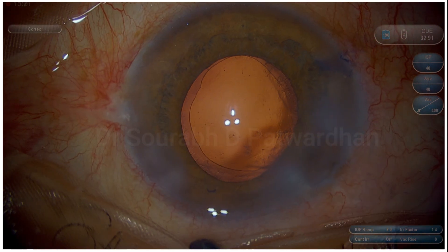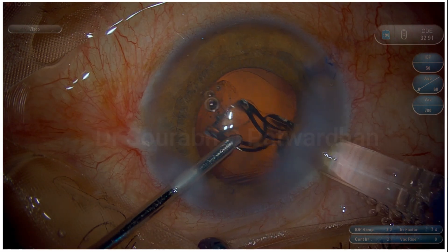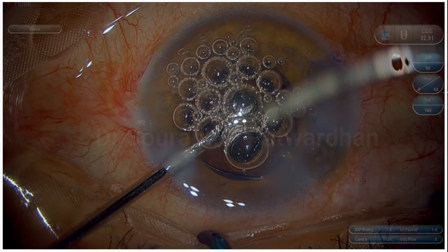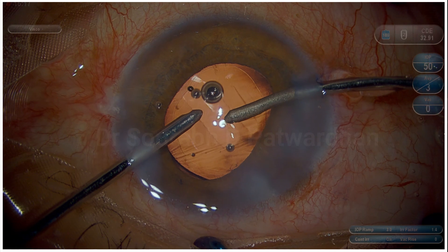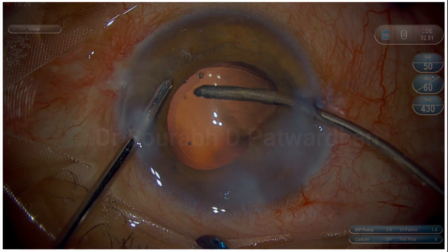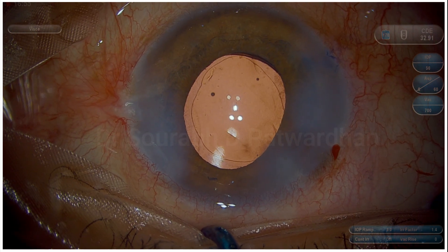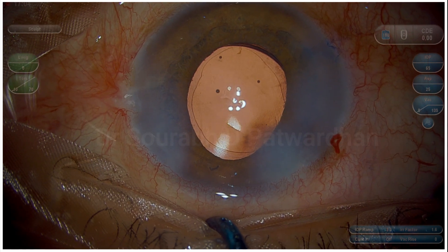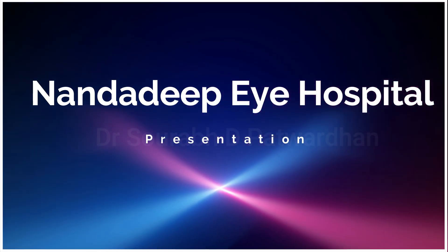IOL implantation is done by the surgeon using irrigation in the left hand and injecting the IOL through the main incision, using the aspiration port to nudge the IOL into the bag and aspirate out the bubbles. The IOL goes into the bag — well done. The cumulative dissipated energy (CDE) is around 33, quite acceptable for this kind of hard cataract. This patient is going to have a very crystal-clear cornea the next day. Keep analyzing yourself, become a self-coach — listen to what your coach would have said in that situation. Thank you so much.